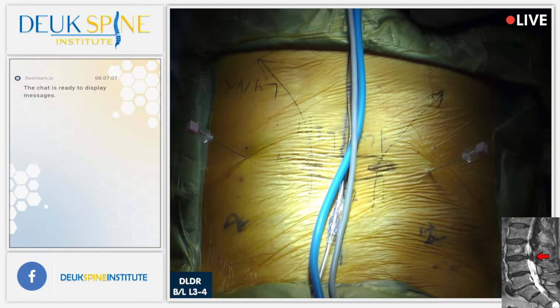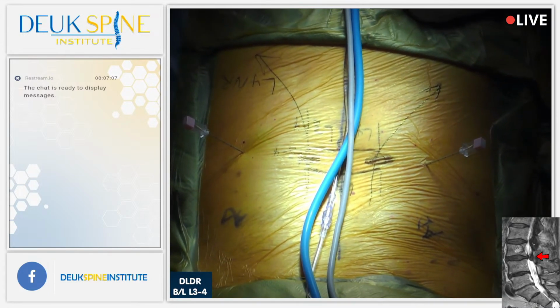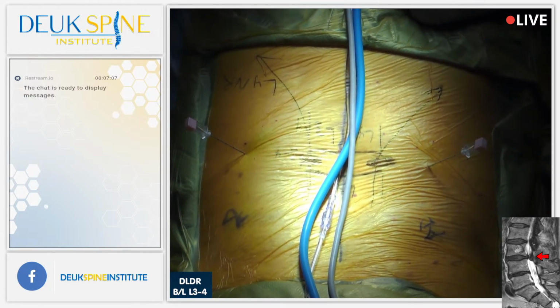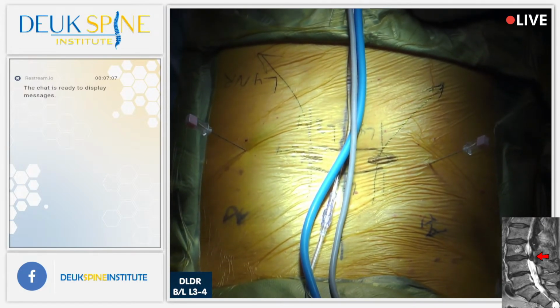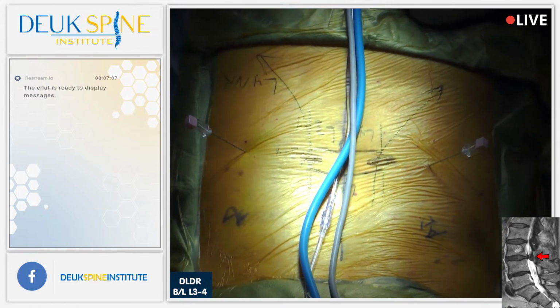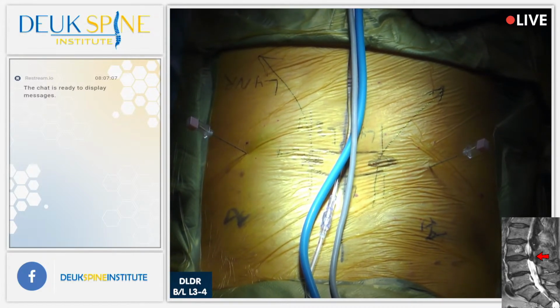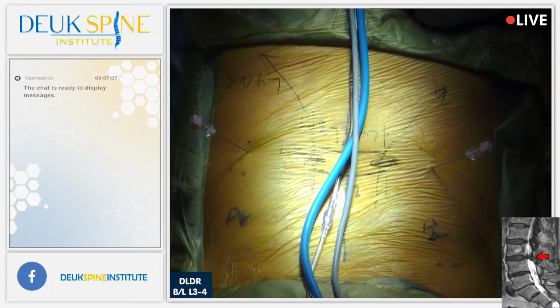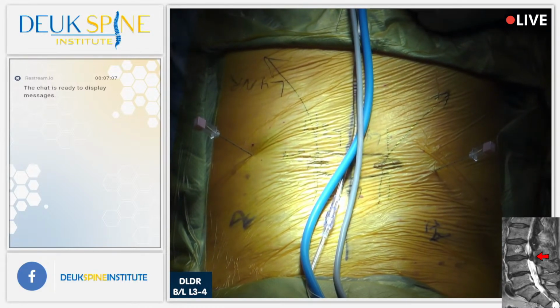You know, the biggest risk of this surgery is there's a lot of risk that could happen. We could end up putting the metal pipe in somebody's stomach or intestines, and then that would be really bad. They would need emergency surgery to repair it. We could end up causing an infection. We could end up damaging a nerve root. These are all possibilities, spinal fluid leak. So to avoid the complications, you have to know how to get those complications as a surgeon, and you have to pay attention throughout the surgery that you're not endangering any of those structures.